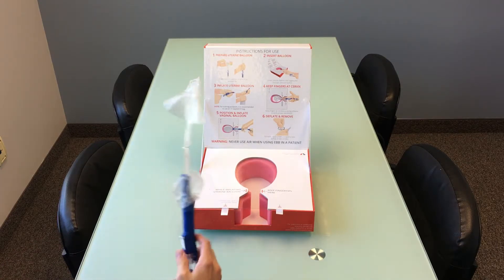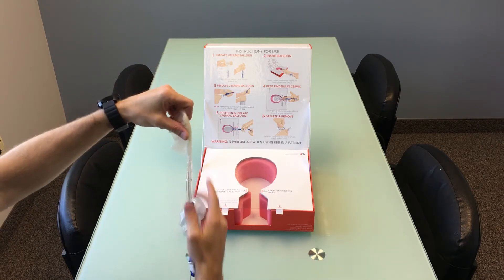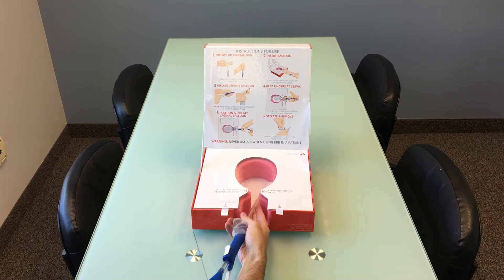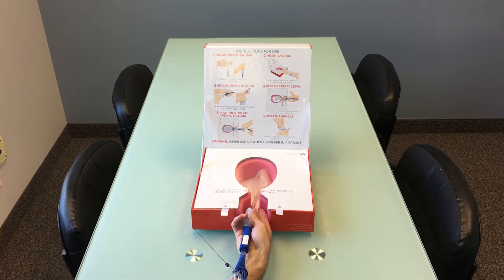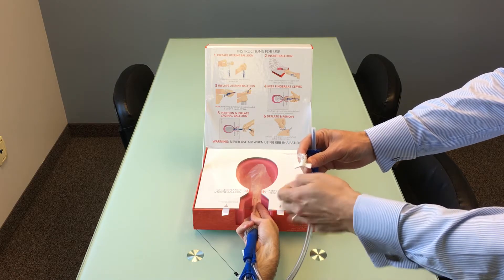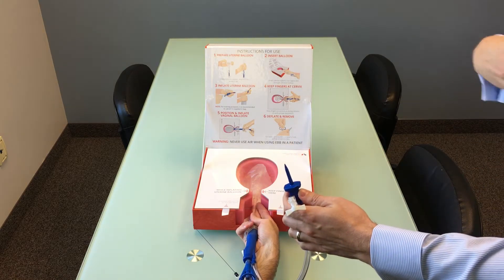Now simply follow the steps printed on the top part of the box. Step one is to prepare the uterine balloon — wrap the balloon around the catheter and insert it into the uterus. With your IV bag full of air, you're ready to inflate. Ensure to close the stopcock, remove the spike cap, and simply spike the bag and squeeze.